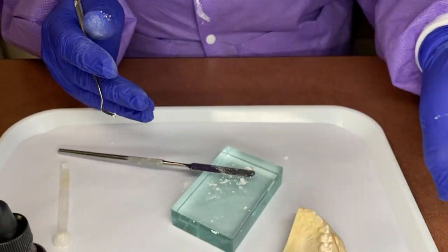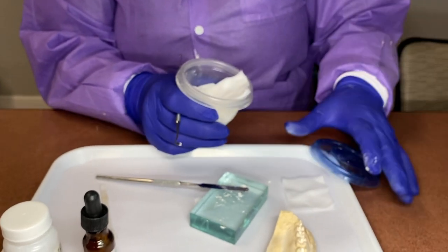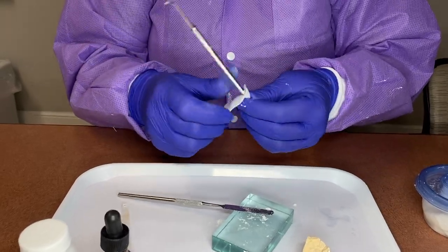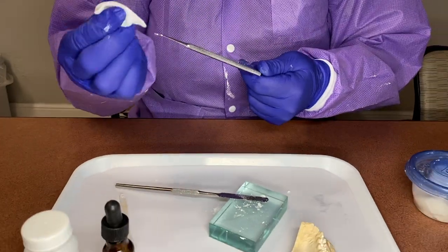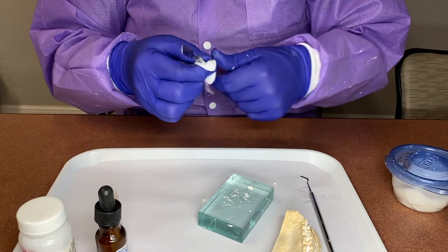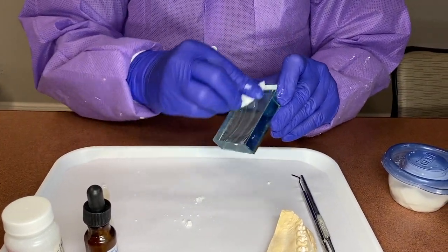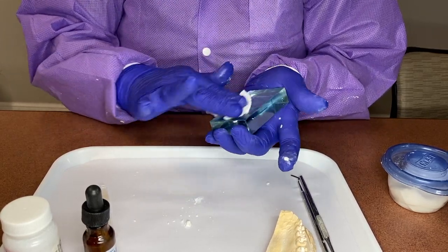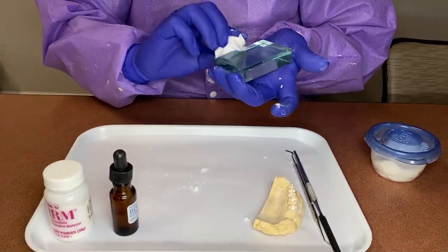Last but not least, I'm going to take an alcohol 2x2, just one. Close it back up and always clean off your instruments. Don't leave anything behind that's dirty, because we have to make sure that everything's cleaned off, because we use these over and over and over. So you want to make sure your spatula is clean, and wipe off the IRM. And now we're done with IRM. And that's how you do it.